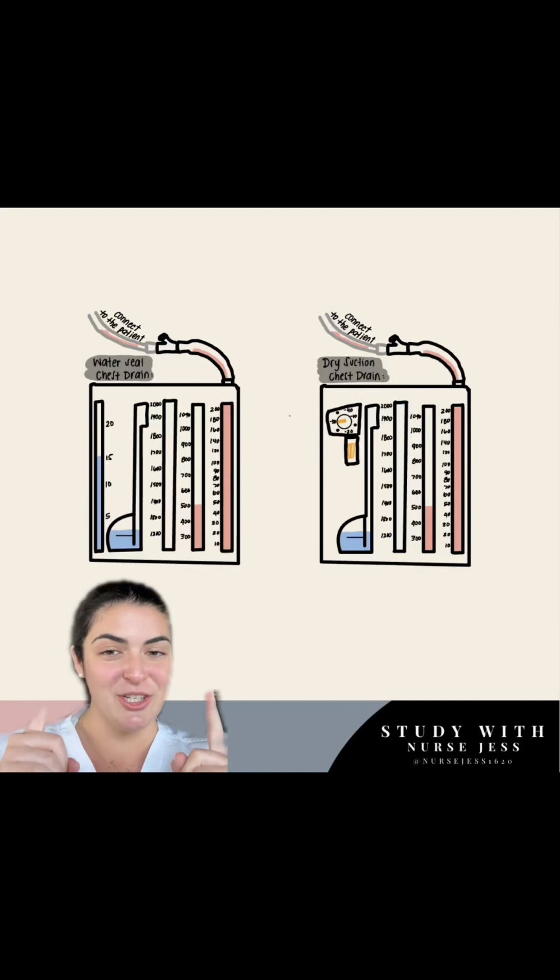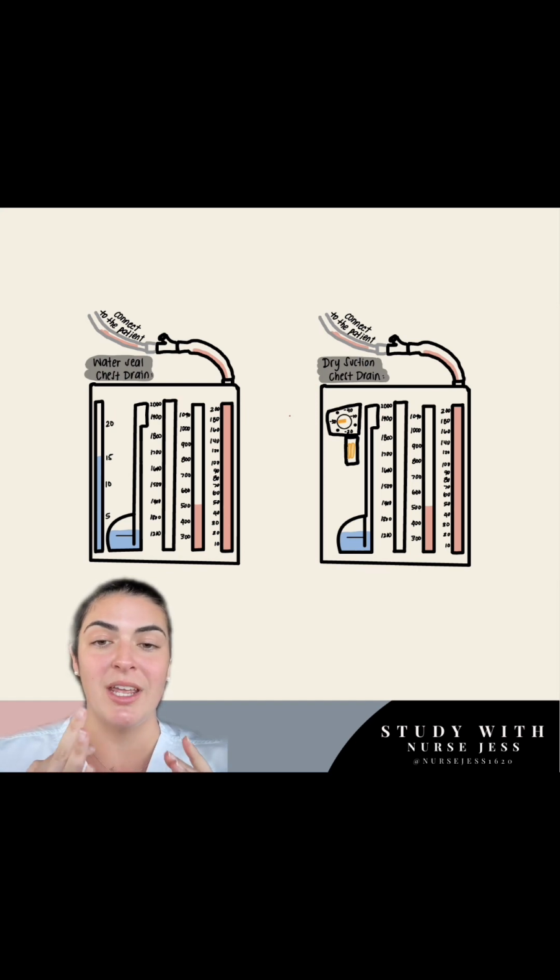All right, guys, let's talk about chest tubes. So what are some indications for chest tubes? Typically, if an individual has air or fluid within the thoracic cavity, we will put in a chest tube to drain that air or fluid.